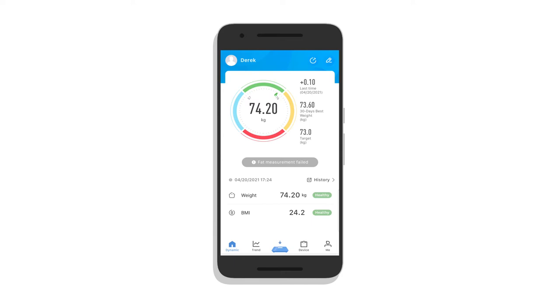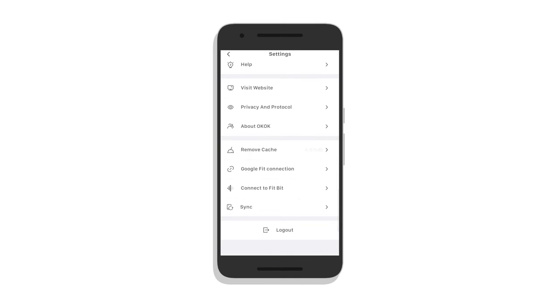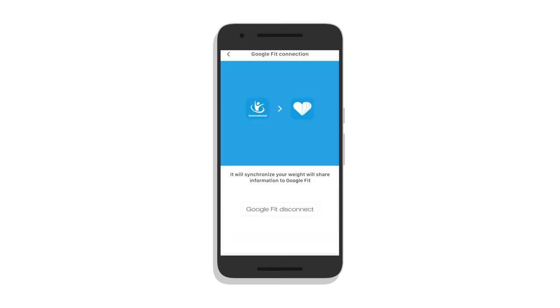I also need to download Google Fit — or Apple Health, or activate it, however it is on your phone — and establish a connection from OKOK to Google Fit. I go to my profile, open my settings, and then click on Google Fit connection. Now I've established the synchronization to Google Fit.